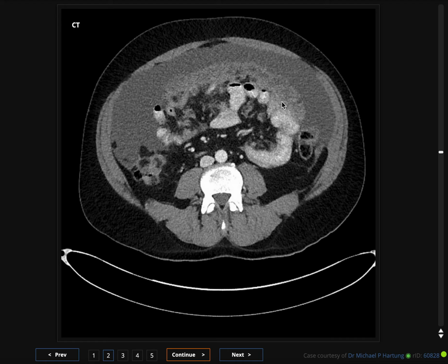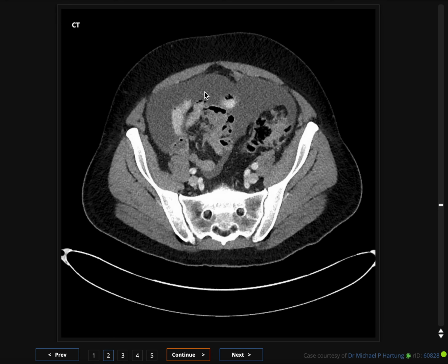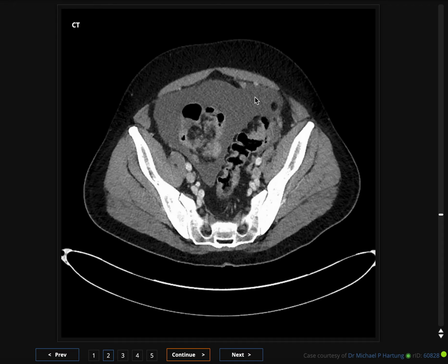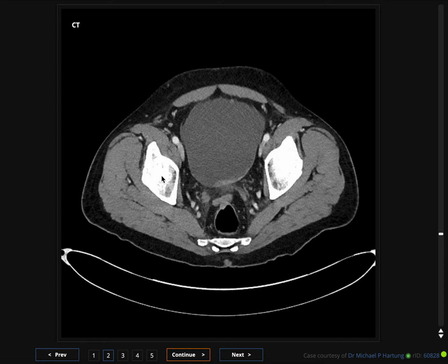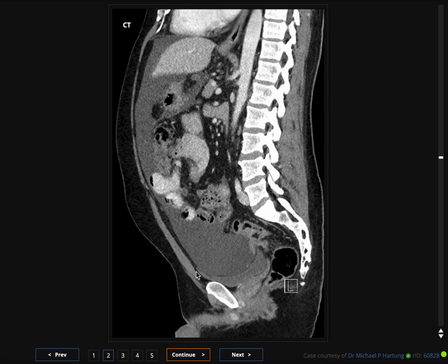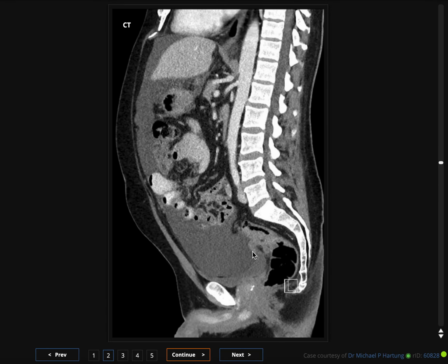So the thought that comes to mind is that this is omental nodularity from cancer metastasis, or whatever other disease can cause it, but cancer is the first thing that comes to my mind. Now there's ascites, there's omental nodularity. Now I'm really looking carefully at the peritoneal lining again to see if I see any deposits. And right around here, I do see some peritoneal deposits. Let's look at it in sagittal. It may be easy. So the bladder is compressed down here. This is all ascites, and there are some nodular deposits that make me think cancer.